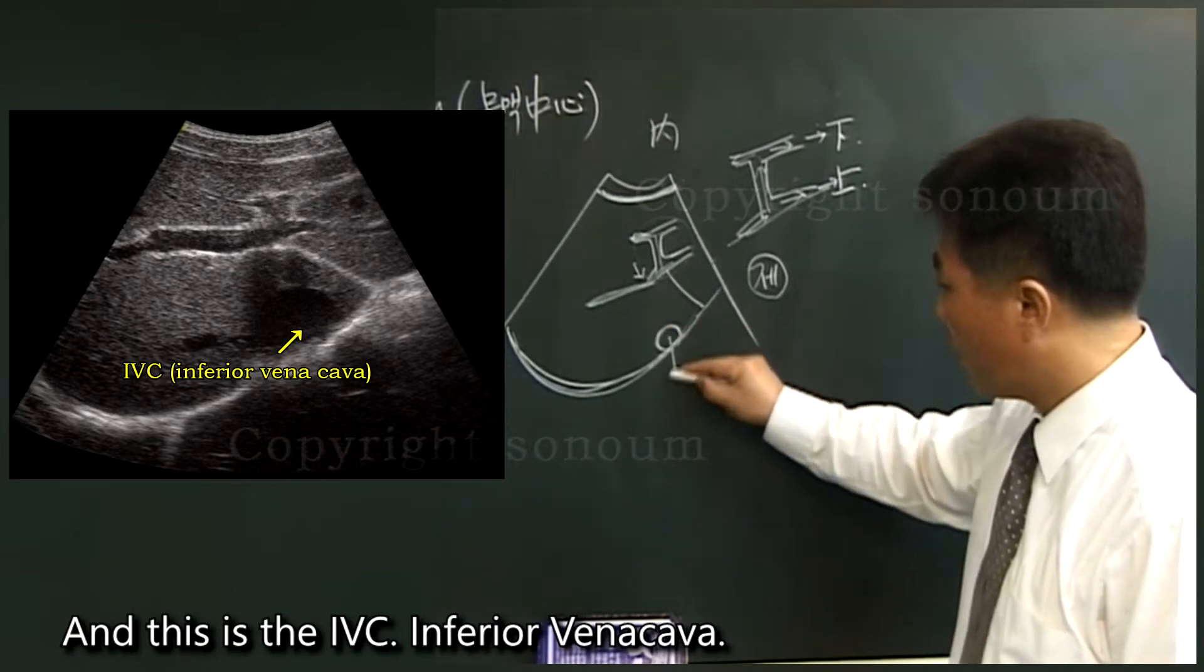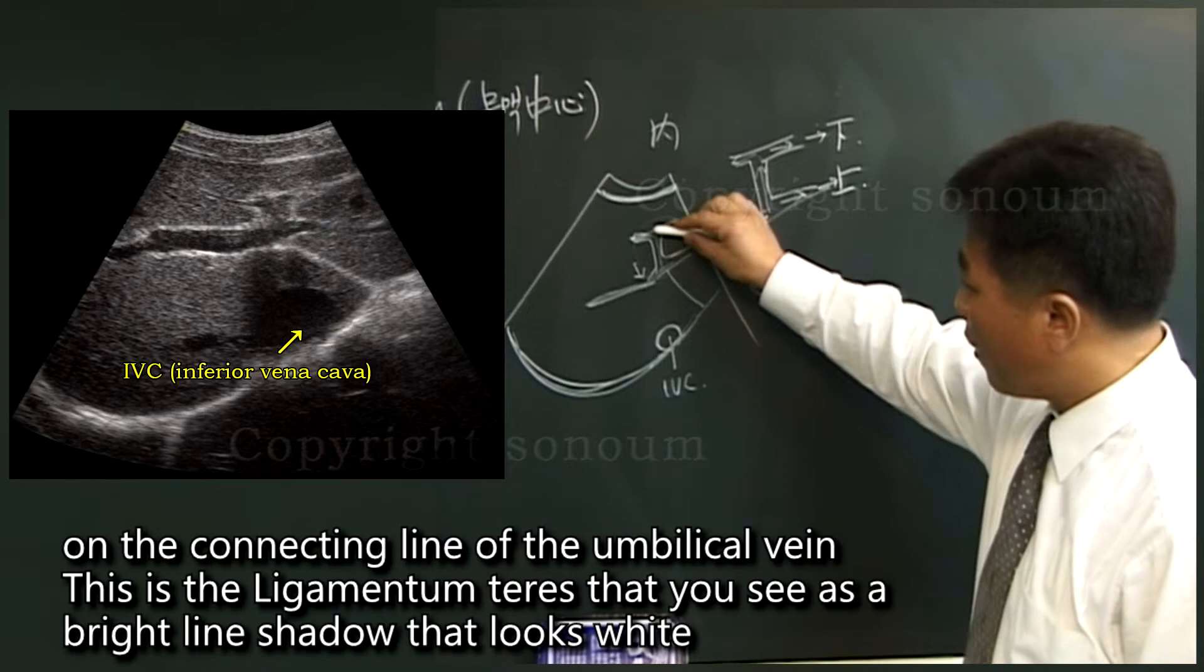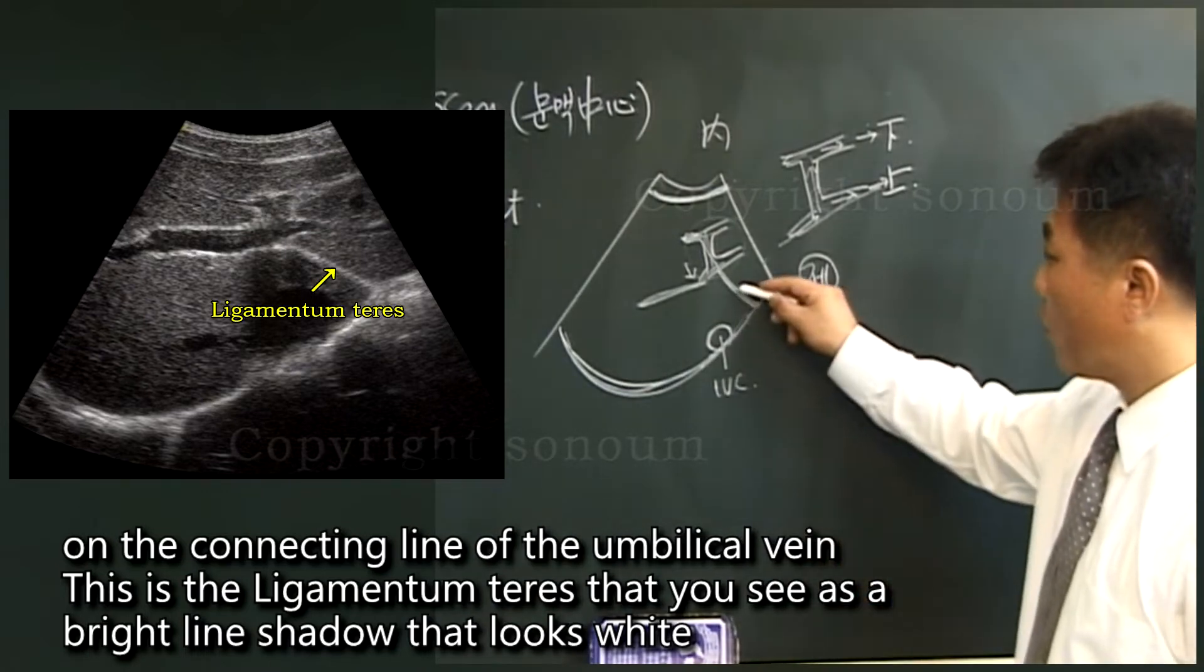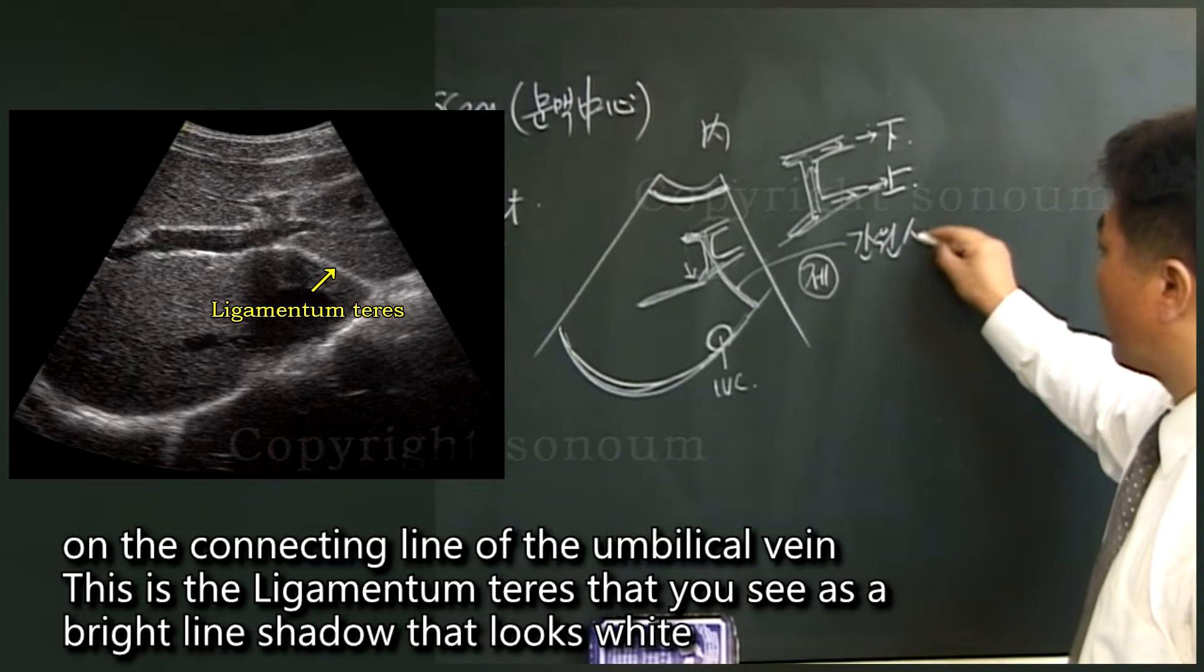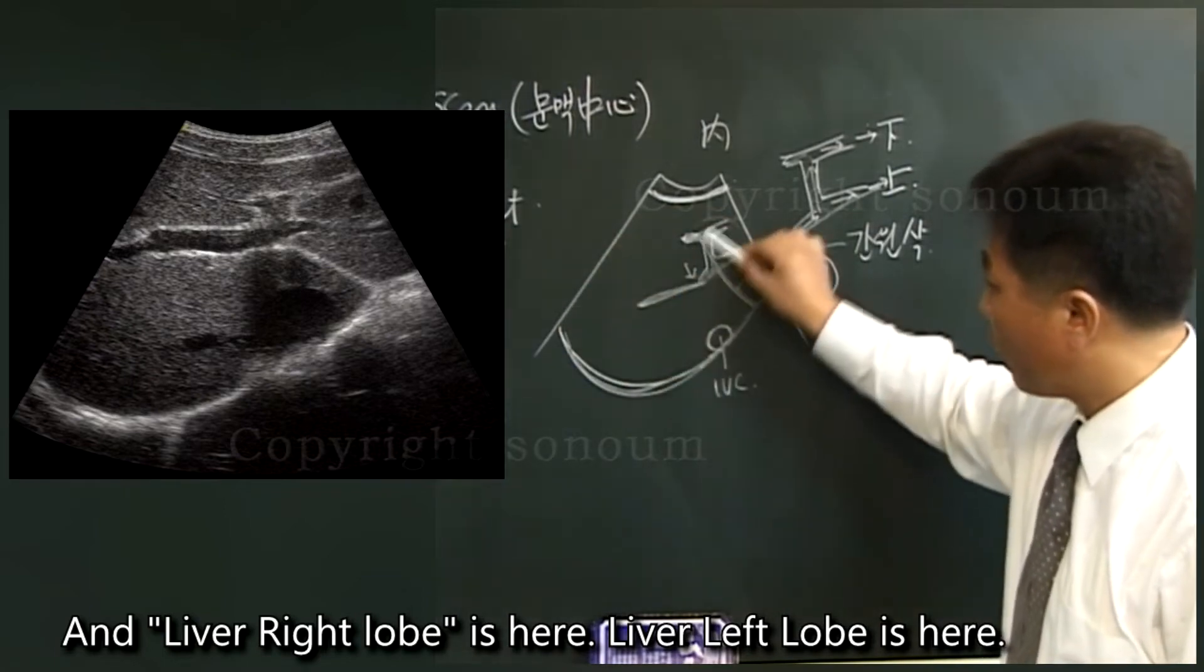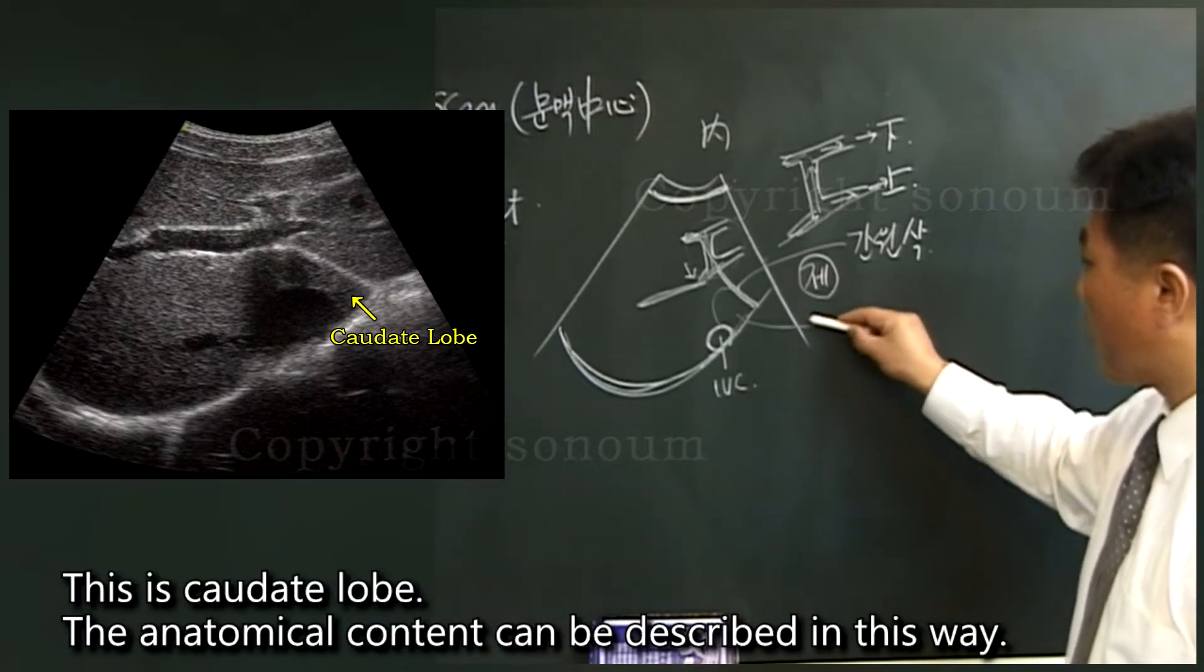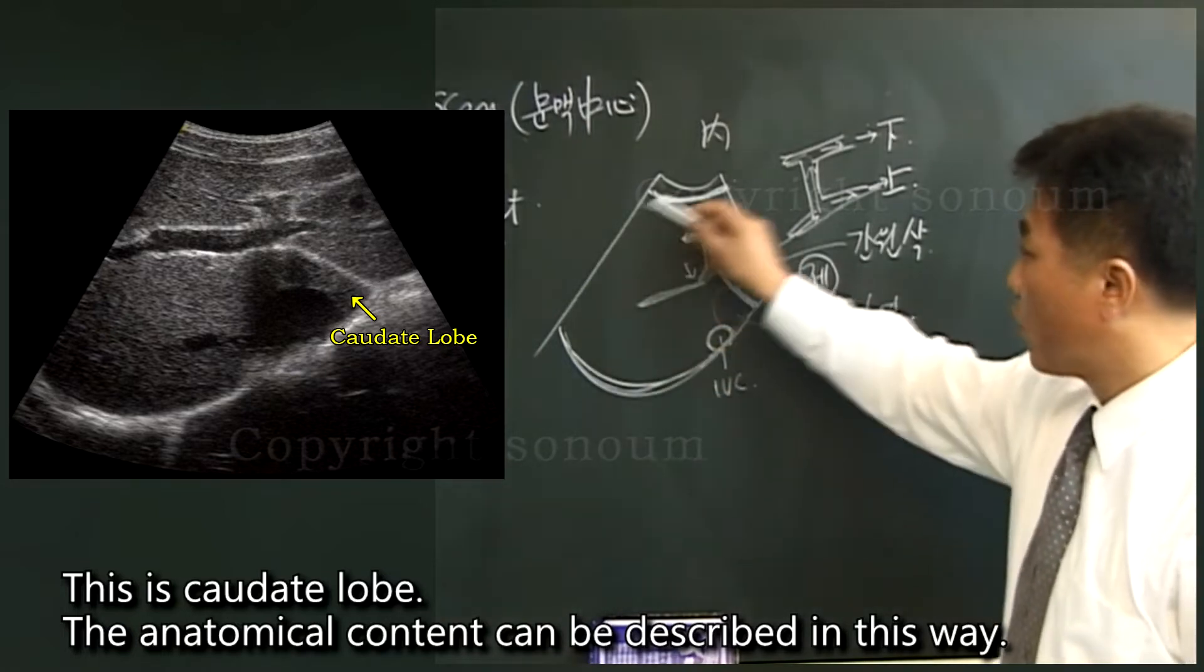And this is the IVC, inferior vena cava. On the connecting line of the umbilical vein, this is the ligamentum teres that you see as a bright line shadow, that looks white. And liver right lobe is here. Liver left lobe is here. Between IVC and ligamentum teres, this is caudate lobe. The anatomical content can be described in this way.